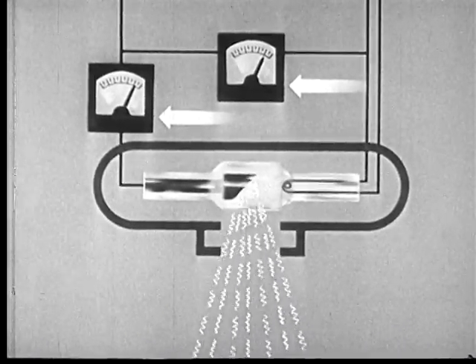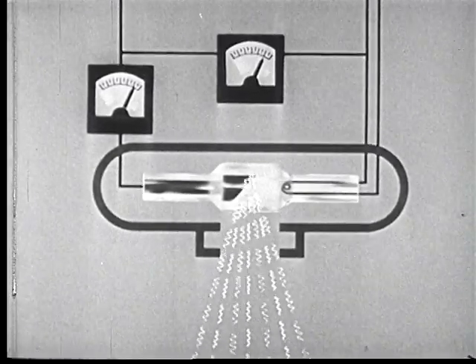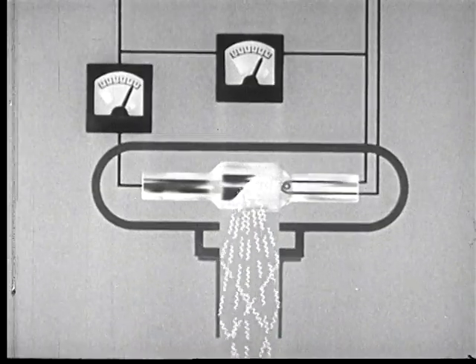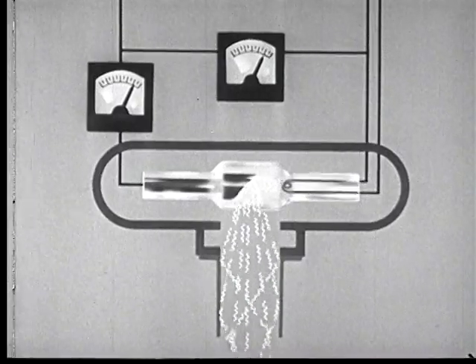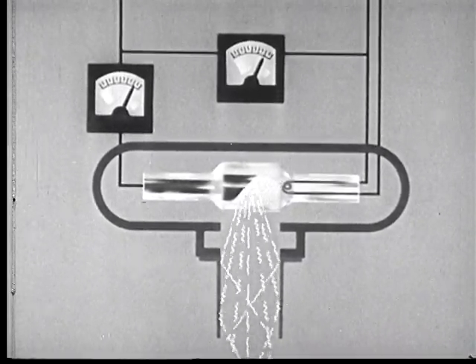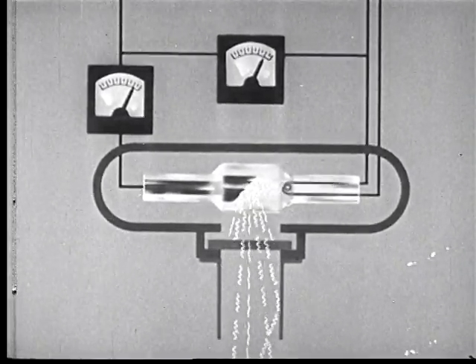For medical use, X-rays are applied to fairly small areas, so it's necessary to restrict the radiation. A lead cone, or a lead plate with a hole in it, may be used to reduce the scattering of the rays. In actual operation of an X-ray machine, different types of rays are produced. Since some of these rays are of a type that is not desired, they're screened out by means of filters.